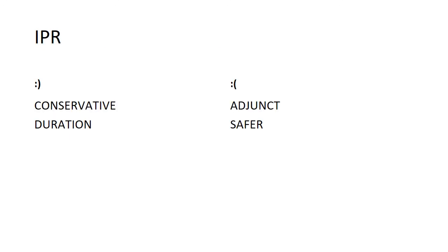So we've learned so much about IPR. The good thing about IPR is that it's a very conservative method of creating space, and yes, it decreases the duration of treatment in a very mild case of space requirement. In that case, you need not extract the tooth. Whereas if it's a moderate to severe case, obviously extraction of a tooth is the only way out to create the space. So in a very minor case, it decreases the duration of treatment and it's a very safe method of creating space. But then there are drawbacks also.